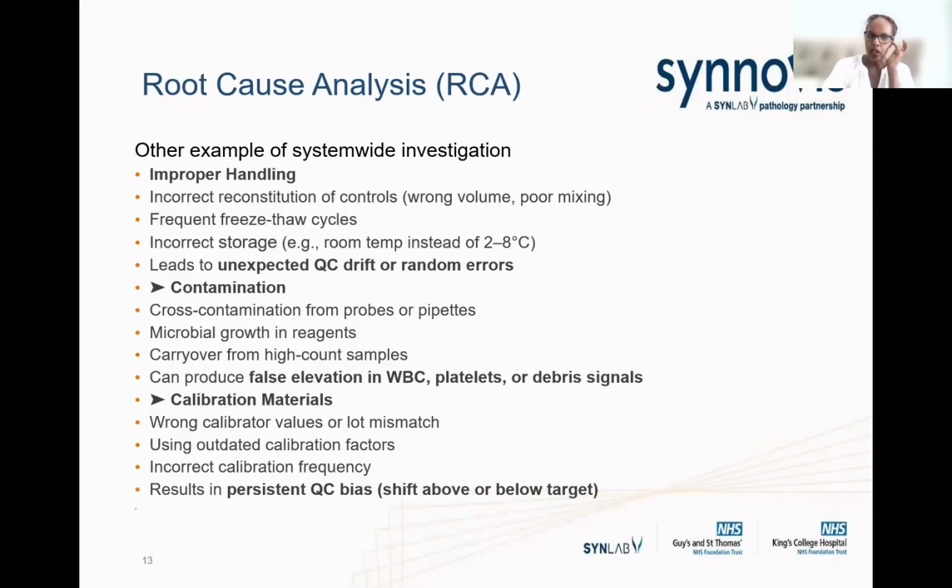So these are just extra things to consider when you're investigating. Improper handling as well is really important. I've already mentioned removing your QC from the fridge and leaving it on the desk somewhere after you run them. So incorrect reconstitution of your control, so the wrong volume.